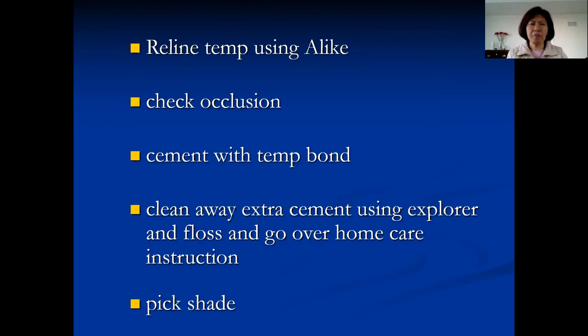After finishing, reline the temporary with a light-cure material. If relining, grind away the material inside completely and outside a little bit so the new material bonds — you cannot reline onto old, soiled material. Check the occlusion, cement with temp bond, clean away extra cement with an explorer and floss, and review home care. Don't forget to pick the shade — you don't want the patient to go home and then have to bring them back just for that.